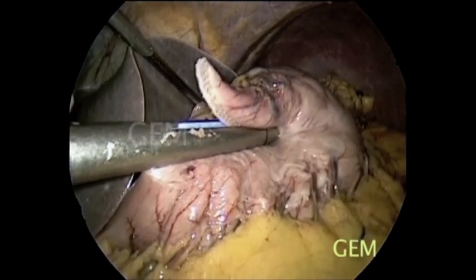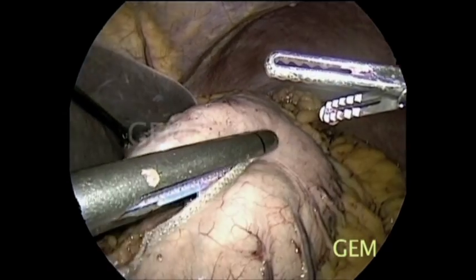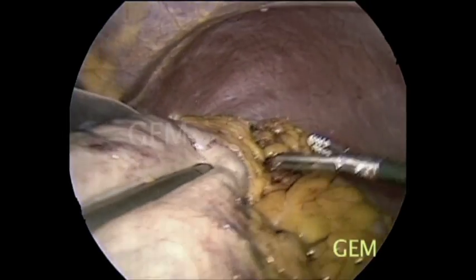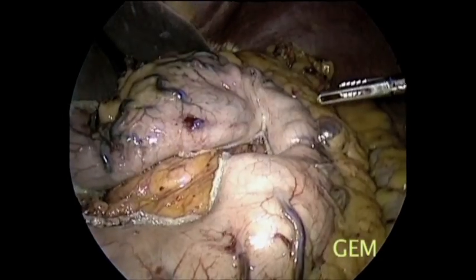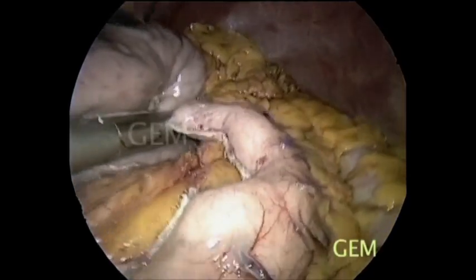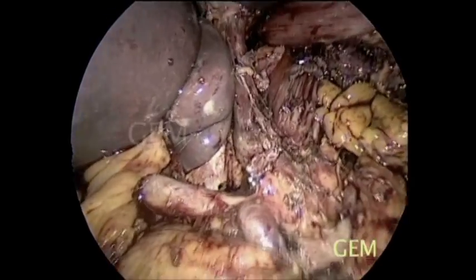Once mobilized completely, we make a gastric tube starting from the lesser curvature using the endocutter, keeping it as broad as possible — minimum 5 to 6 centimeters. We leave adequate length along the specimen to achieve a margin-free resection.